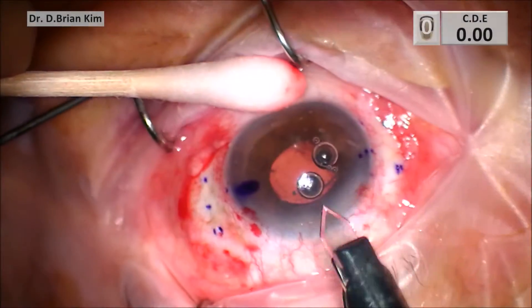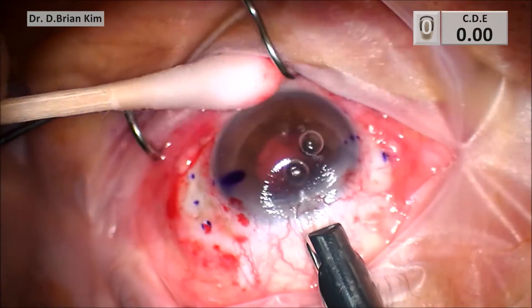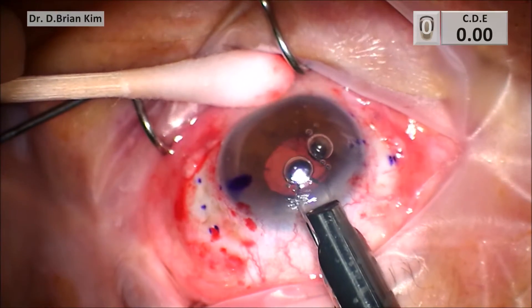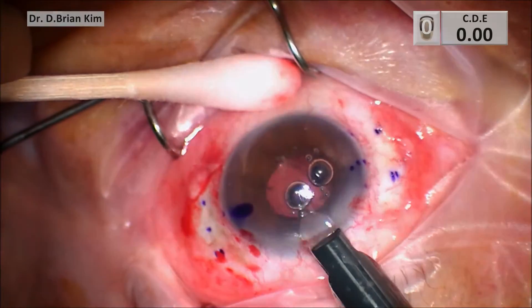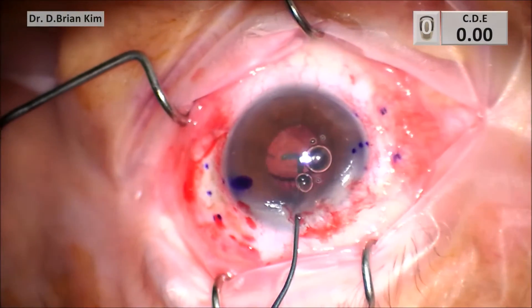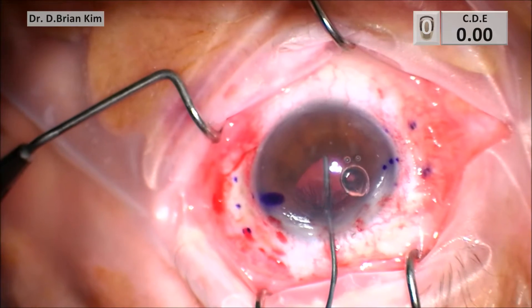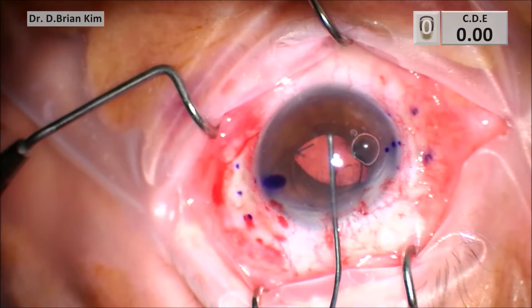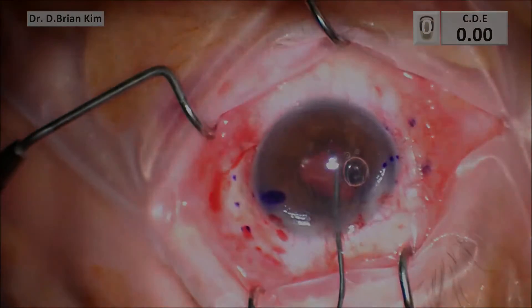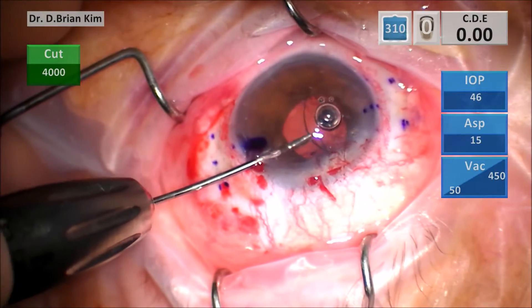I'm using a 3 millimeter diamond blade to make my superior corneal incision. I'm widening the incision a little bit to prepare for all the intraocular manipulation. I'm using my reverse Sinskey hook, which I use for my DSEK, to prolapse the optic into the anterior chamber. In retrospect, it probably would have been just as easy — maybe easier — to just use intraocular forceps to do that.